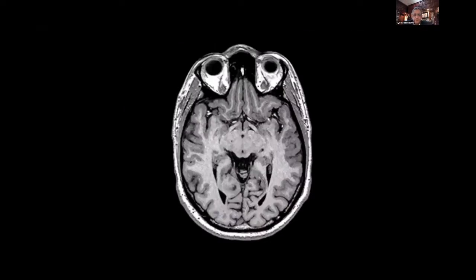Okay, in this we are going down. We see the olfactory gyrus much better over here. The orbits are starting to show up. The globe is showing up over here. In some of the images, you can see the muscles pretty well. But don't fool yourself into saying that an optic nerve is here, because optic nerve will only be the center of this. Now, over here, you see this structure, this inverted V.